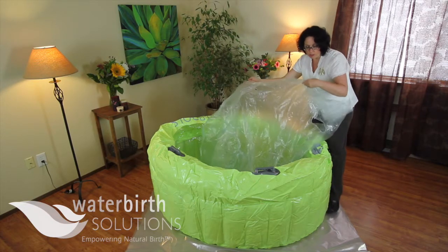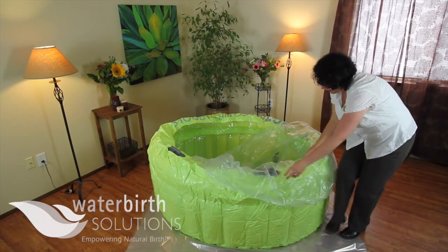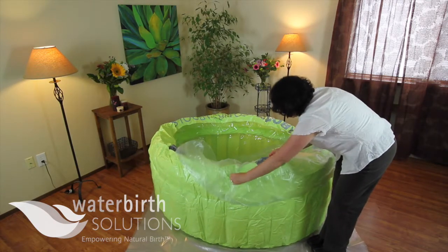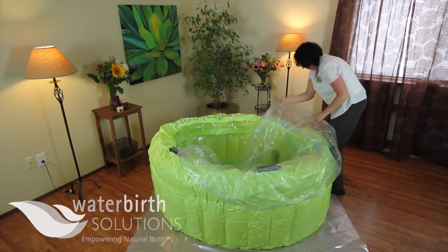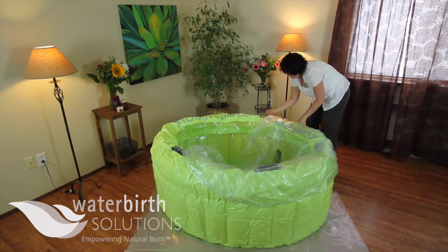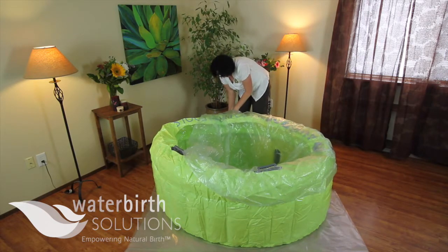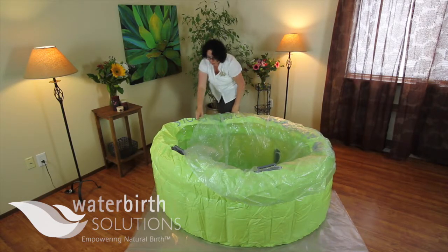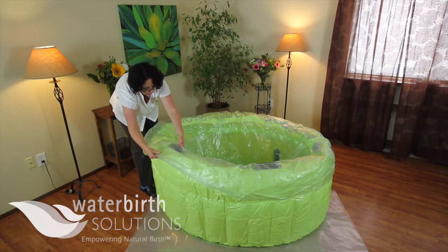I'm inserting the liner into the pool and I'm going to locate the handles on the liner. There are four exterior handles and I'm going to wrap the liner around the pool as I move around, and then I'm going to begin to inflate the pool. As the pool gets more and more firm it will secure the liner around the pool.